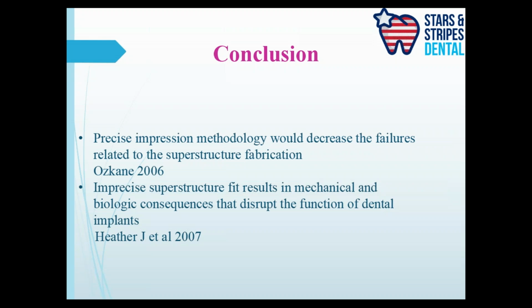Okay, so in conclusion, precise impression methodology has to be there for the successful restoration. It doesn't matter whichever technique you use. Okay, pretty much all the techniques give the same result if you follow the protocol well. So it doesn't matter, whatever is your convenient way of doing impressions, do it, but you have to have an accurate impression material to record the impression properly, and then go ahead and make your prosthesis last longer.